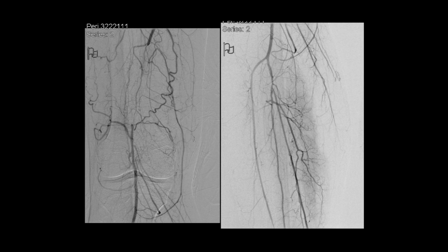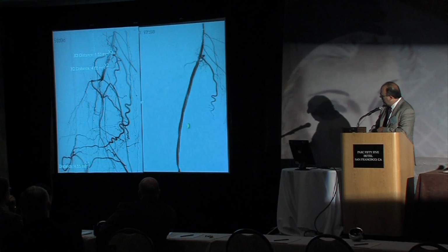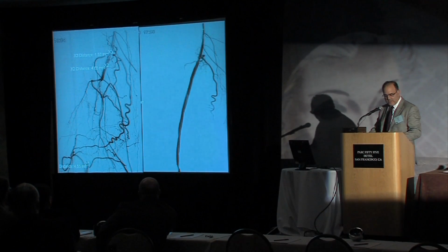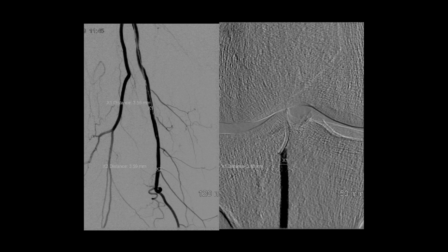Here's an example, one case that we did, one of my partners. Looks like a reasonable case for a stent graft, except the vessels are relatively small. We do quantitative angiography, but they didn't calibrate the system, and they over-measured the lumen of the vessel. And you can see that this device, even though it's a small device, looks like it's oversized once it's in. 3 months later, it's occluded, and when I measured this and quantitated it, it's really a 3.5 millimeter vessel lumen with a 5 millimeter device, and that's not going to work.